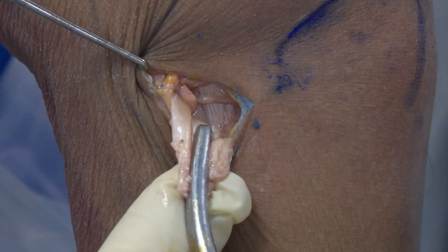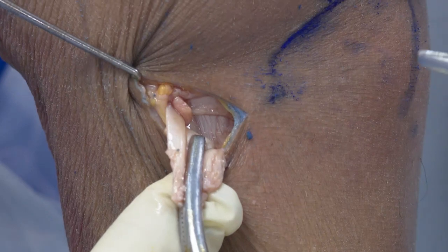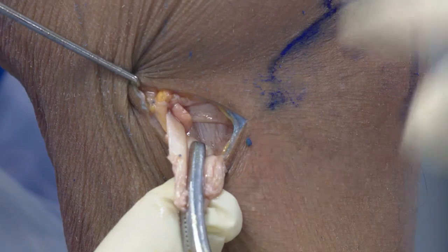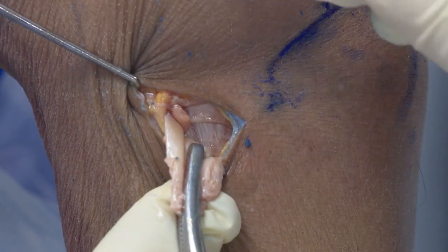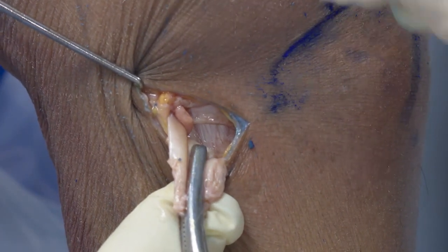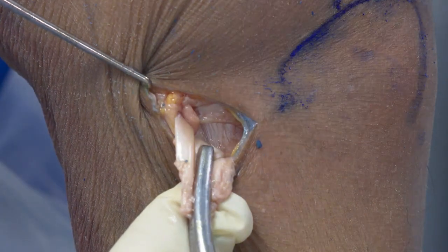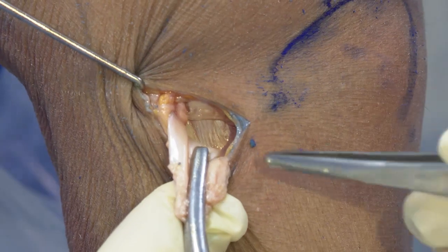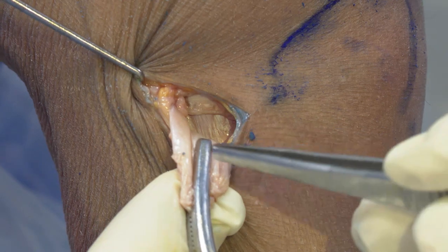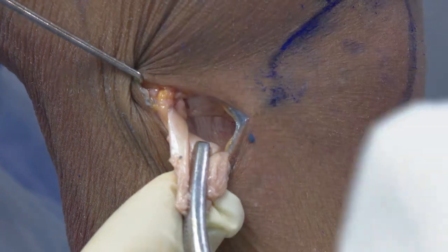So very easy. I have no chance of nerve injury. The nerve is here. The problem is when you do it the other way, sometimes you do a lot of soft tissue dissection and try to find the nerve. And the problem is you go in this area too much. You should not go to this area. You should go lower. And you identify your fascia. Open the fascia like an L shape, right? And then you harvest the graft underneath. Okay. So this way will be easiest. And you get a very small incision. And you can see very well. Okay? So you agree? Yeah.